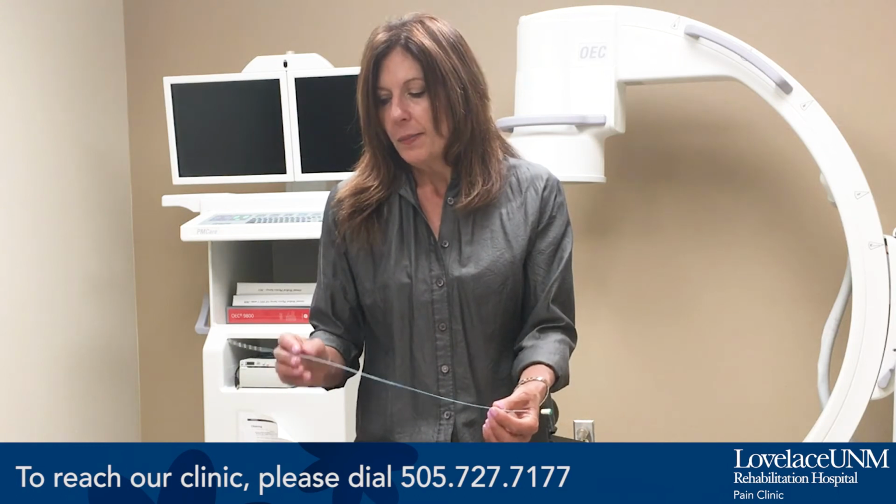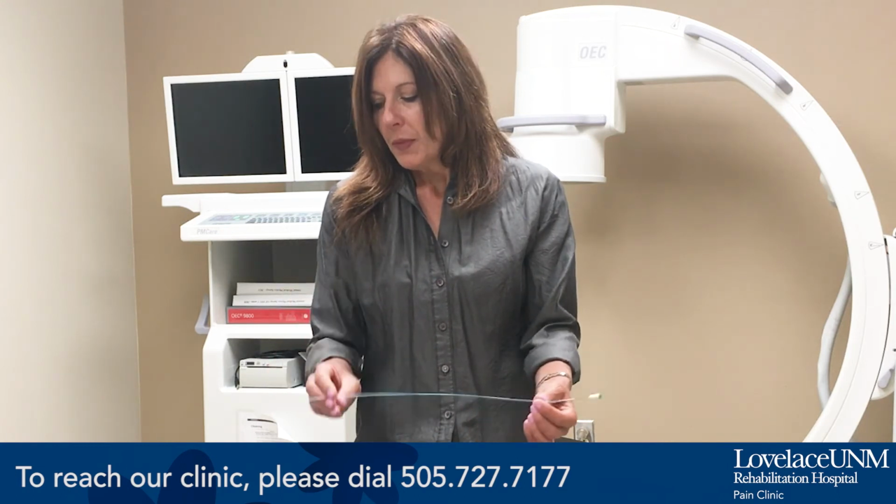During the actual process, the spinal cord stimulator lead is maneuvered up the epidural space, and for low back and leg pain, it is placed in the thoracic epidural space, typically in the mid-thoracic region around T8 or 9. Likewise, in the cervical spine, the lead is placed into the cervical epidural space. Now, I previously stated that in general you're targeting low back and leg pain or neck and arm pain, but there are other indications for spinal cord stimulation, such as abdominal pain, pelvic pain, and there are new indications coming out all the time. Therefore, the lead placement is highly variable depending upon the target you are trying to treat.